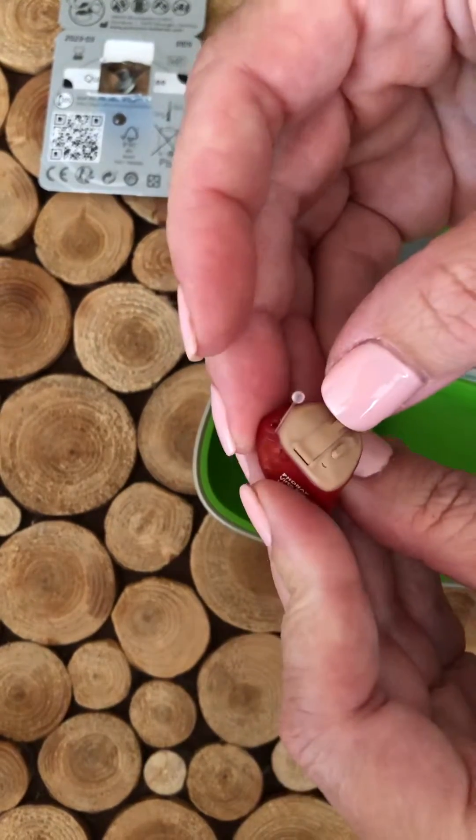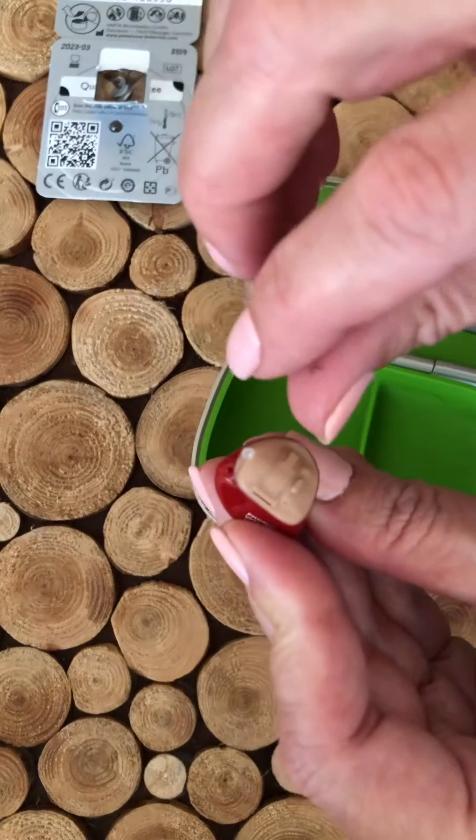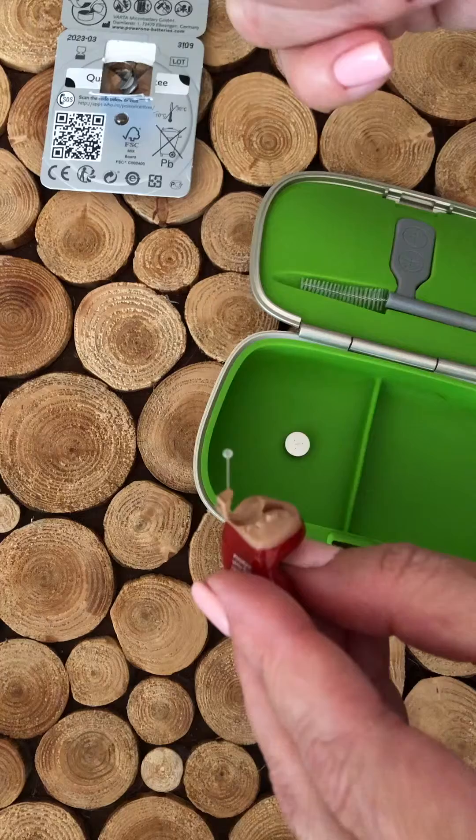We're going to insert the battery. If we look at the faceplate here, this is on the outside. In the middle is the battery door. So using a fingernail, open up the battery door like this.